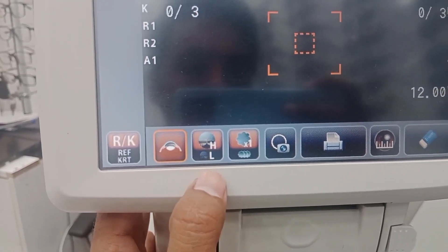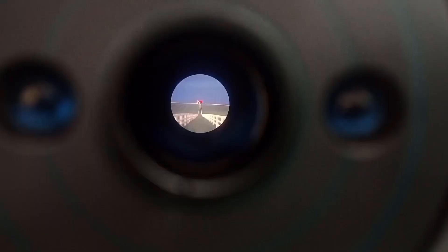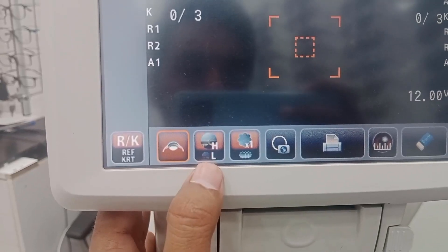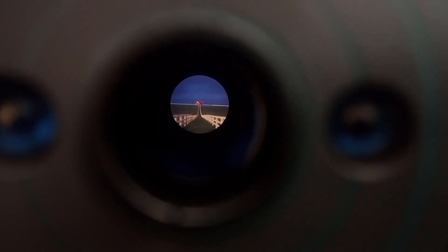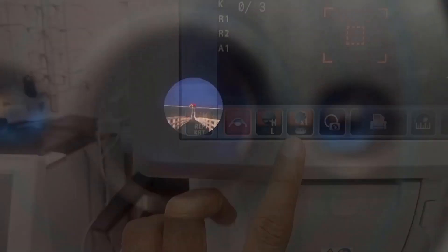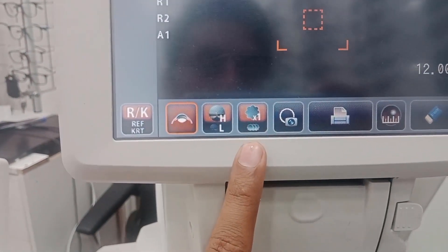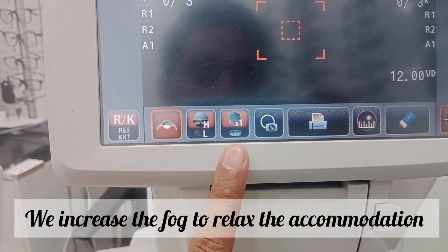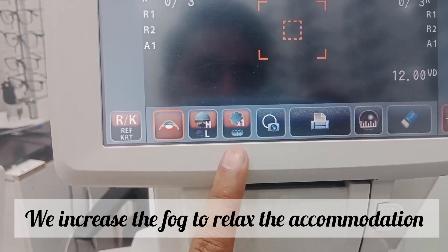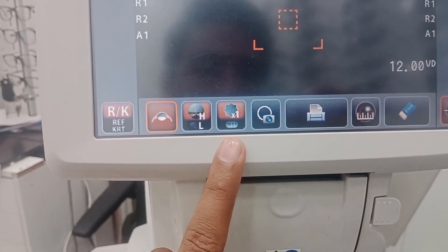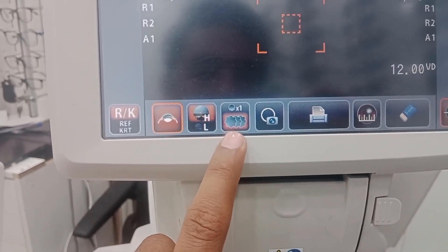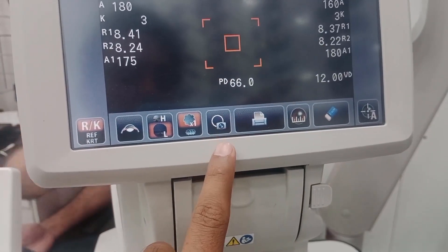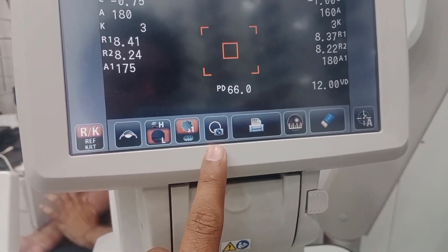H means high and L means low — you can increase or decrease the brightness inside. There is also a fogging setting: you can choose minimum or maximum fogging inside. This is important to relax the patient's accommodation while taking measurements, so you can adjust the fogging effect accordingly.